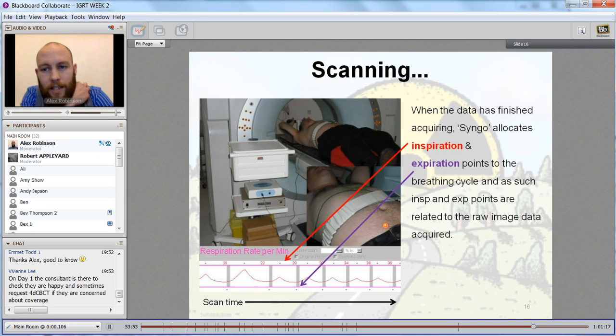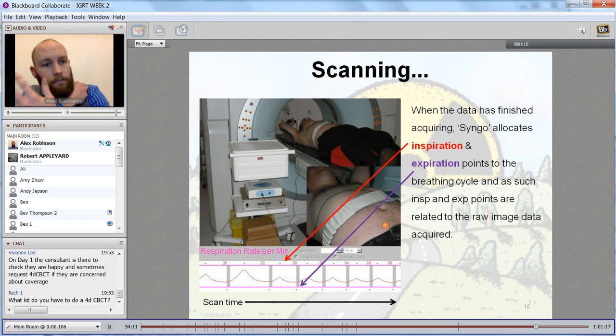However, what we also have to consider is when we're planning it, we still want to try and minimize the volume of normal tissue. So we can still do the 4D CT, but for verification, I'm not sure that'd be required. As you rightly say, however, lower lobe tumours, anything that's really proximal to our diaphragm, definitely. If we're putting the emphasis on 4D CT, then why not do 4D CBCT? Okay, it's just a thought.